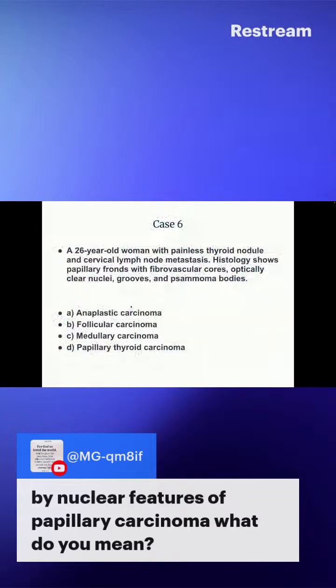Okay, I think this is the last case. A 26-year-old woman with a painless thyroid nodule and a cervical lymph node metastasis. Histology shows papillary fronds with fibrovascular cores, optically clear nuclei, grooves, and psammoma bodies.